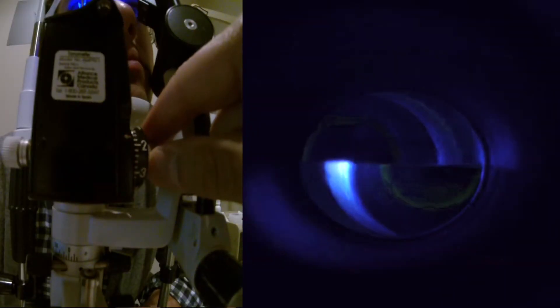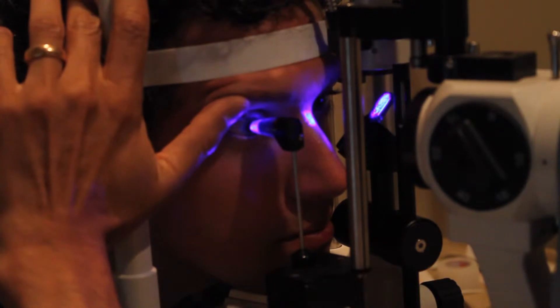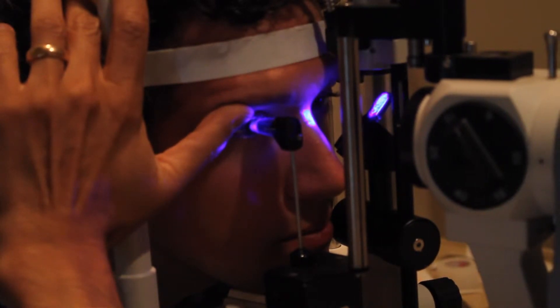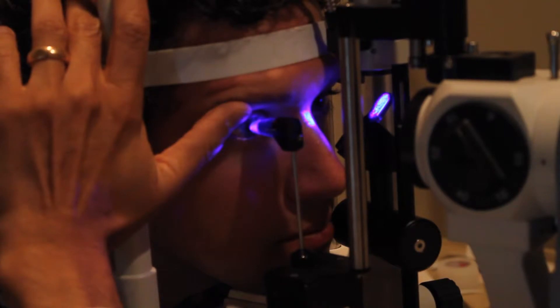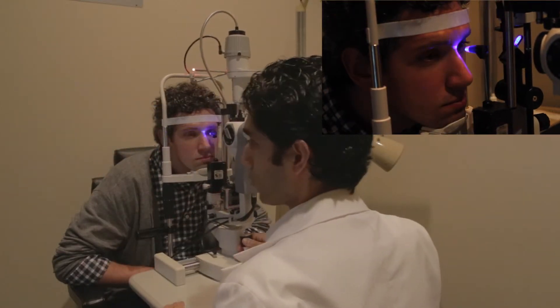Bring the tonometer forward and you can see some lines — the mires. Next, adjust the dial so that the inner parts of the two semicircles just barely touch. If your patient is blinking, you may want to hold the eyelid up, but be careful: pressing hard on the eyelid pushes on the mires and causes them to distort. In this case, there's too much tear film and the mires are quite thick, which introduces an artifact — we'll need to remove some of that tear.